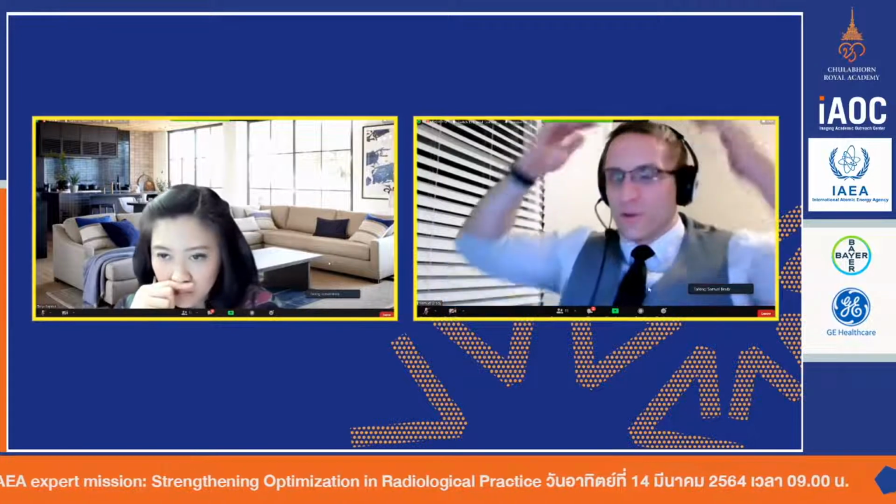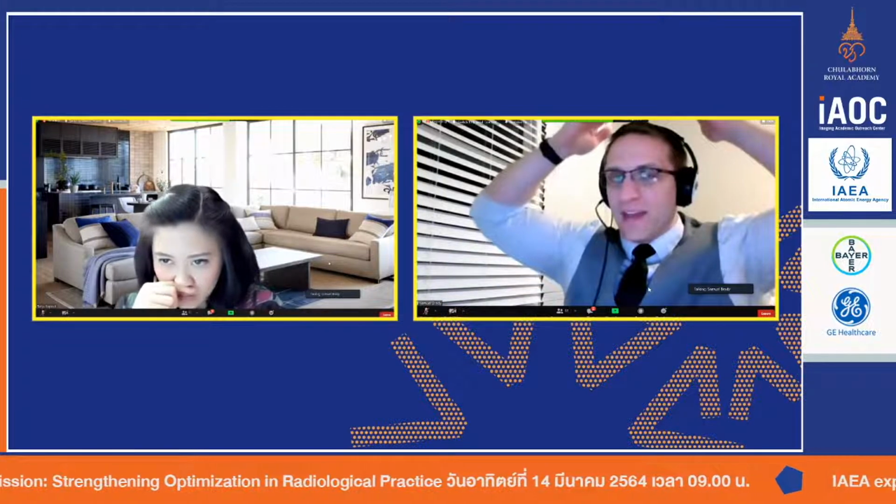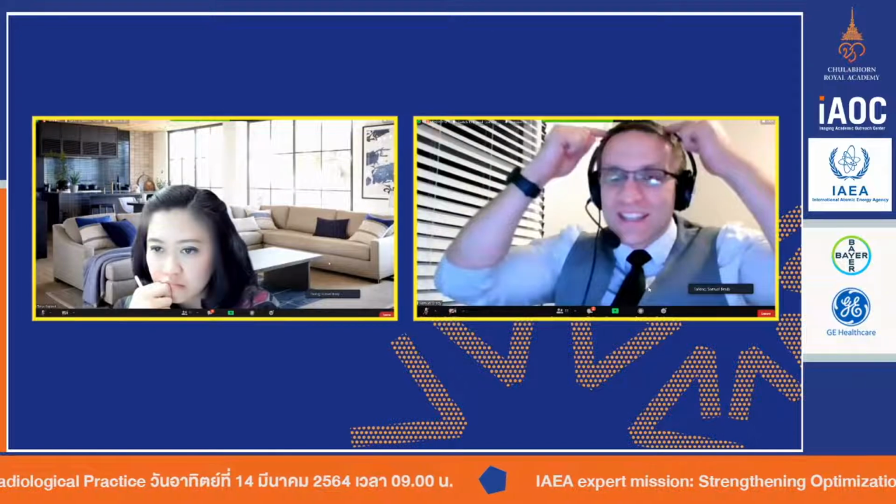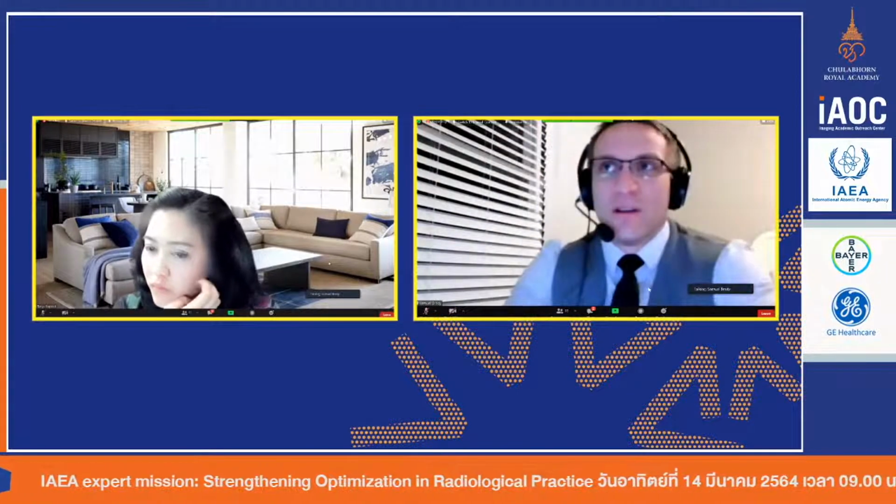And so if you put a lot of air above the head, the problem is the system is not going to actually get the right dose at the top of the head. It's going to take a little bit before the scanner ramps up. And so setting a good scan field of view here and a good display field of view here is the best optimization technique for patient dose and image quality.